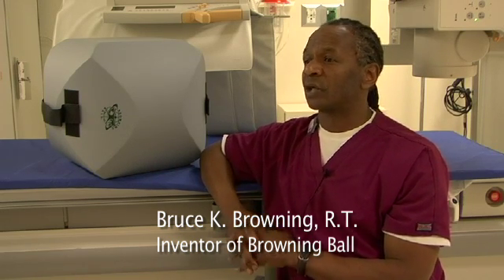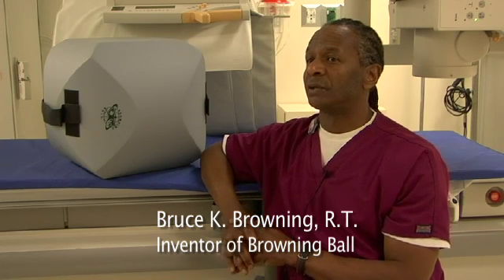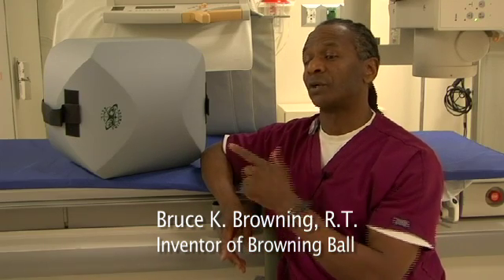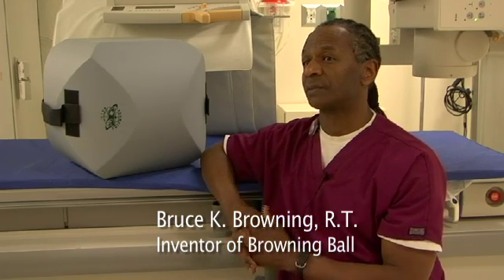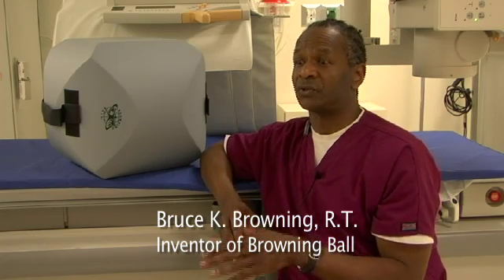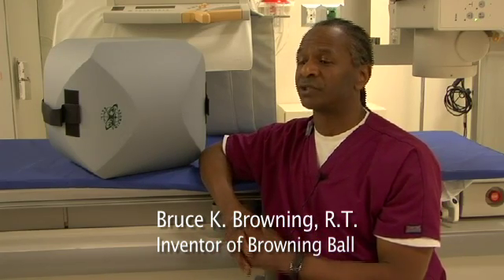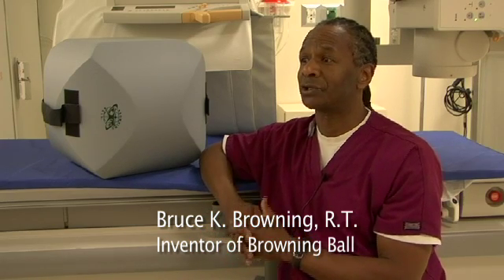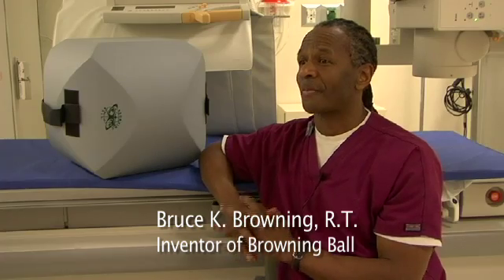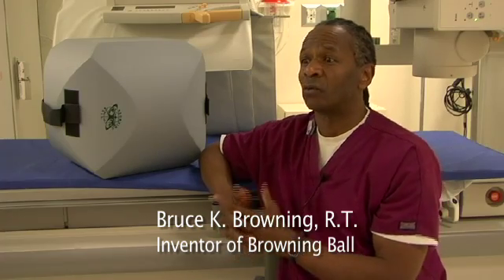The third group are the actual technologists who are taking the images and giving the ball to the pediatric patients. It makes the technologist's job easier to just hand them the ball instead of trying to coax a child into taking an x-ray. Kids just gravitate toward it.